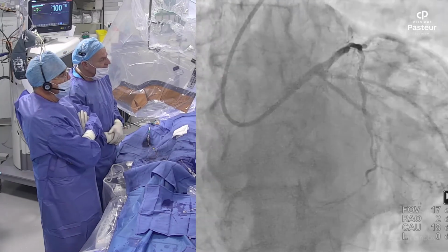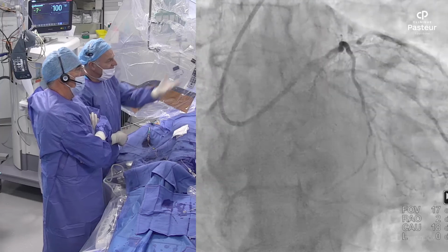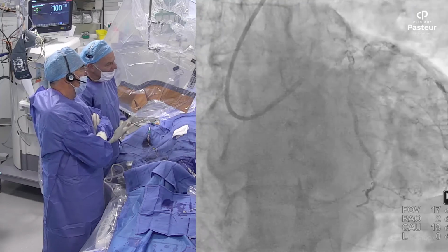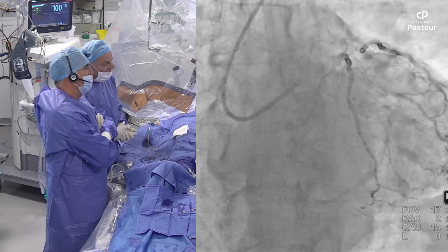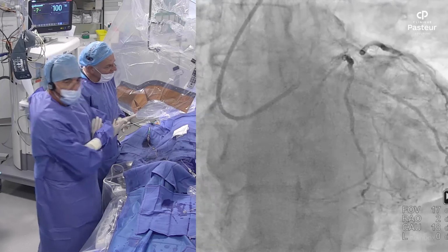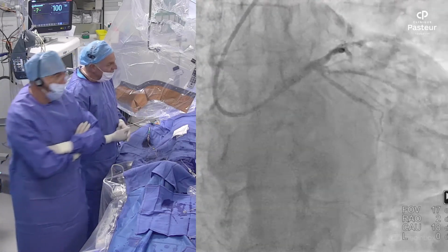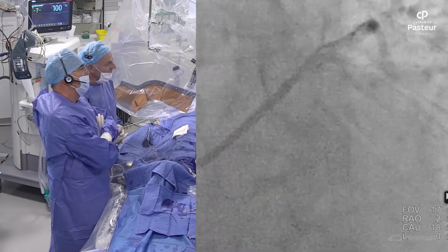We can maybe zoom in on this view, and we can see it's like a calcified plaque, and it doesn't seem to be really severe. And if we rely on the result of the thallium scintigraphy, normally it should not be a severe lesion, because there is no evidence of LV dysfunction and no very large lateral ischemia associated with it.